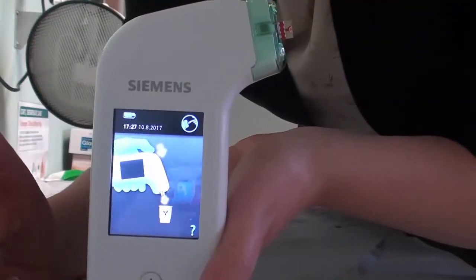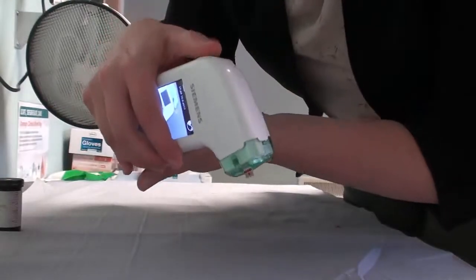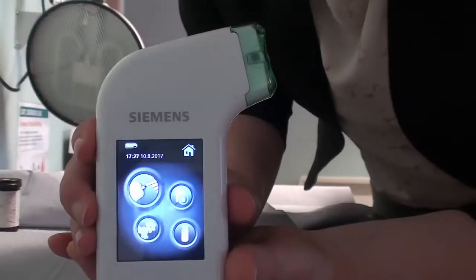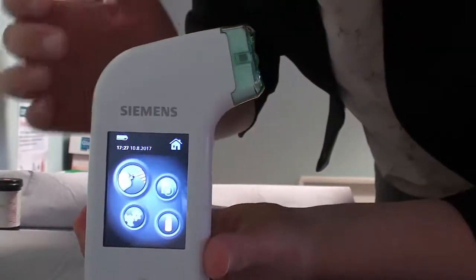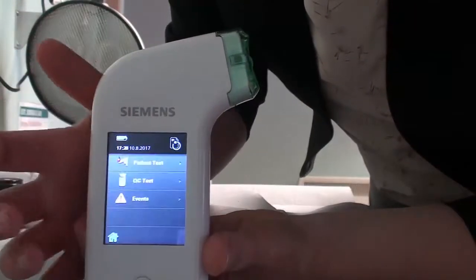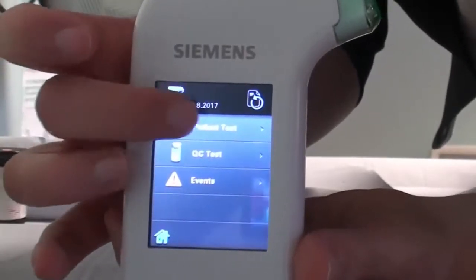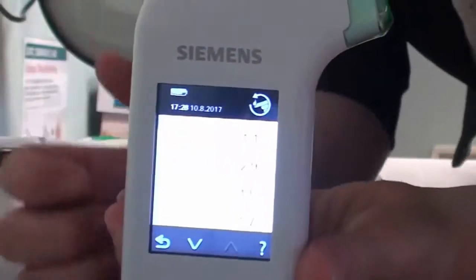It's now telling you to discard the test strip, which is done by pressing this button here. It will now remind you to wipe down the side of the machine, and you can find out what my INR was by clicking on that and then clicking on patient test, and it will tell you my result at the top.